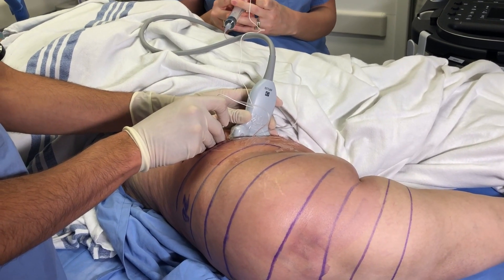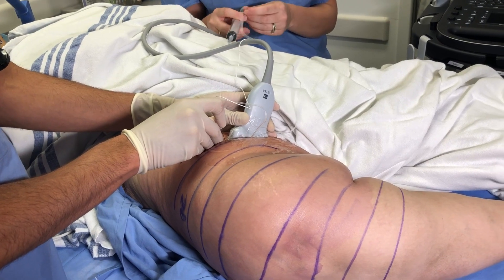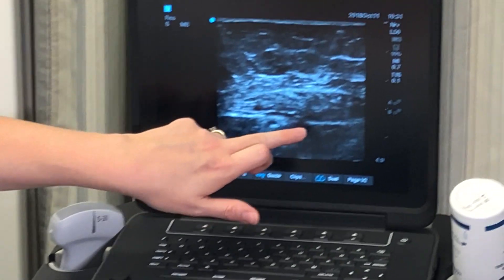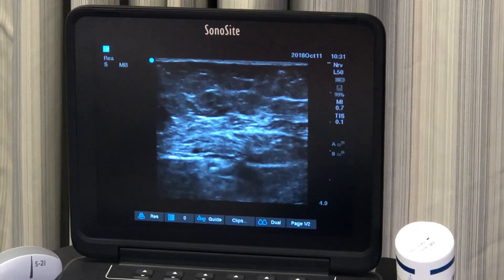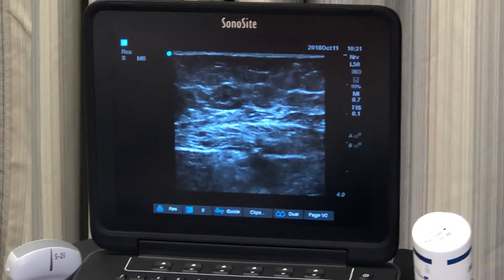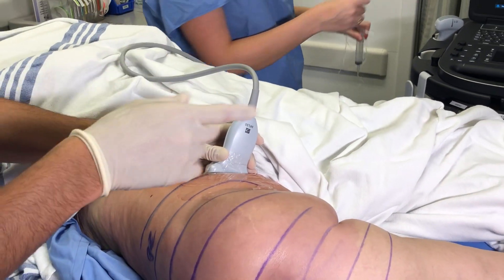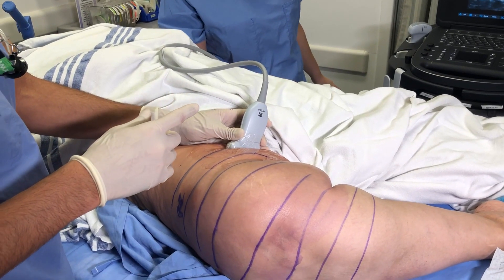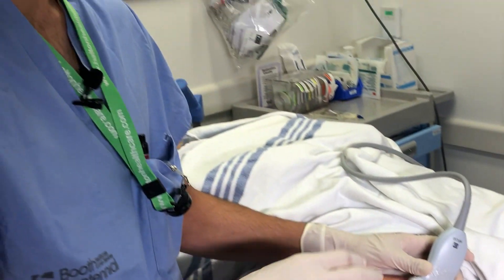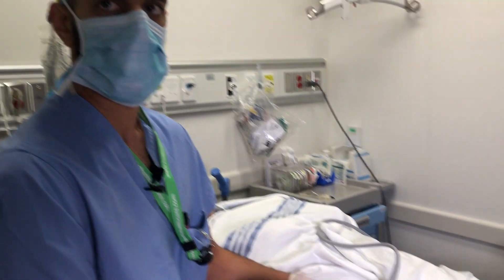So where are you trying to get this freezing? The nerve. In this nerve block, we look for the artery in the leg — the femoral artery. We're putting the local anesthetic around that artery, in the location called the adductor canal. I'm just scanning to make sure the medication is spread appropriately. We know that when the medication spreads in the adductor canal, the nerve travels in that area, and with enough medication we'll get some anesthetic around the nerve to help reduce the pain.